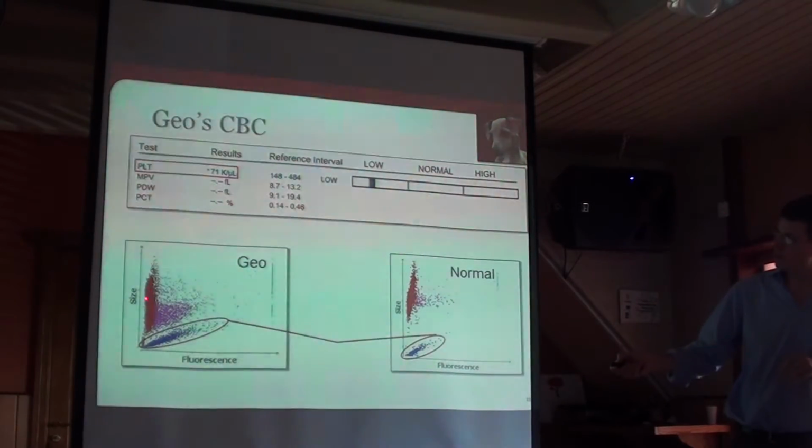So far we've met the red dots, which are the mature red blood cells, and the purple dots that are the reticulocytes.